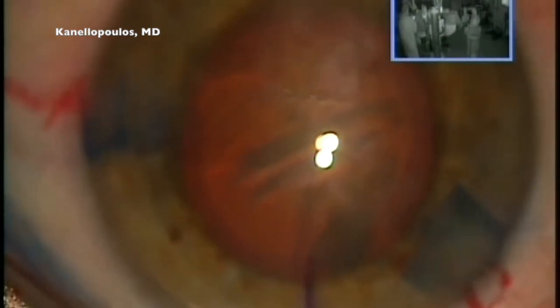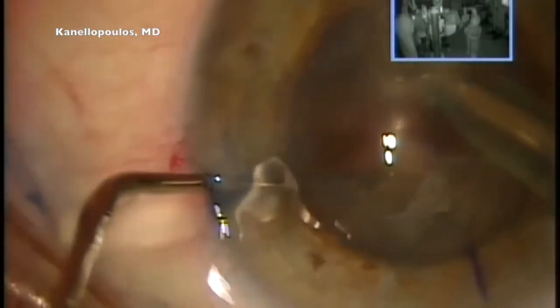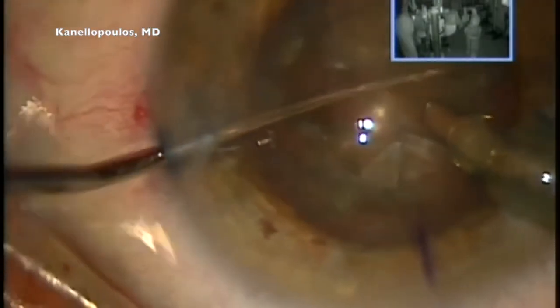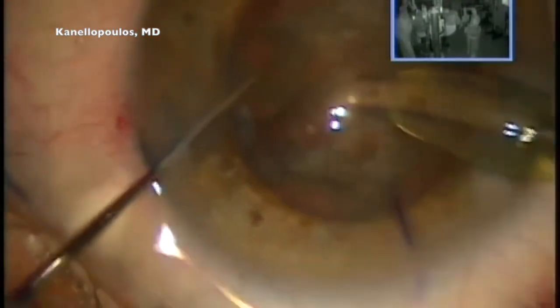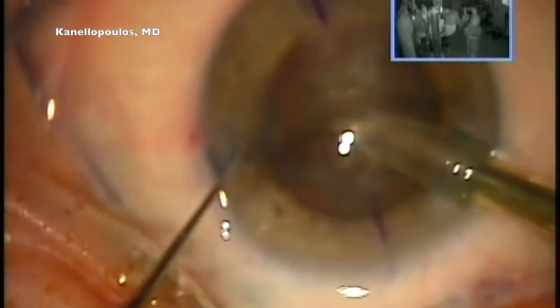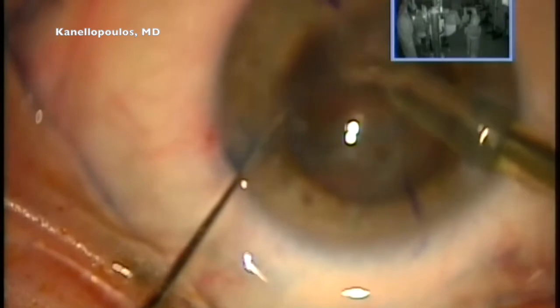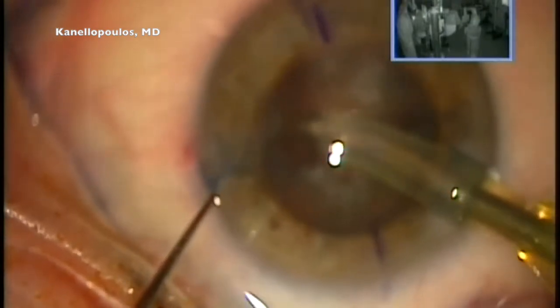there's no pressure. We talked about before that this is a shallow chamber. The actual anterior chamber in this patient is 2.3 millimeters. So despite the peribulbar anesthesia, we also use some intravenous mannitol here to reduce the vitreous volume and create a very nice, and as you can see, quote-unquote flexible environment.